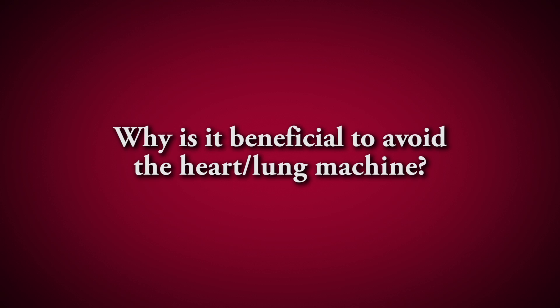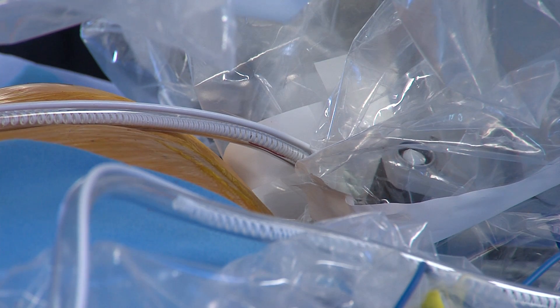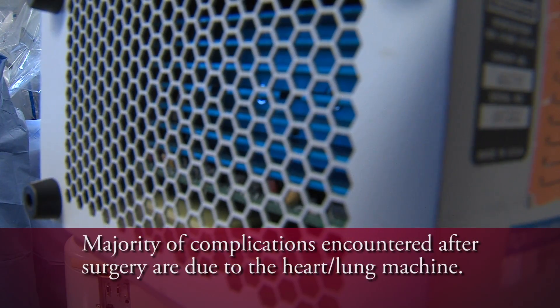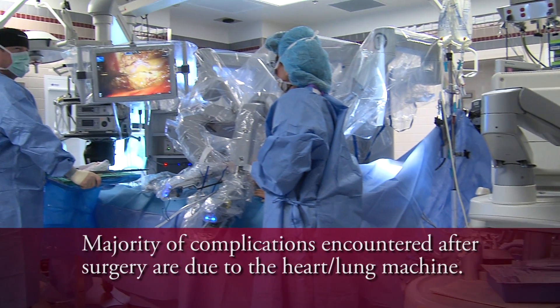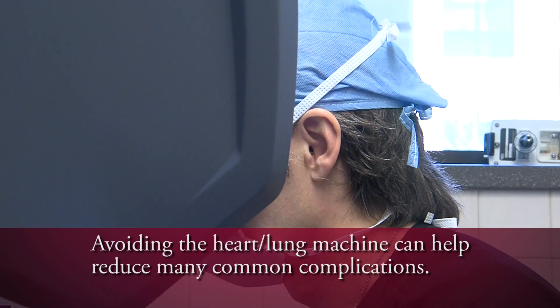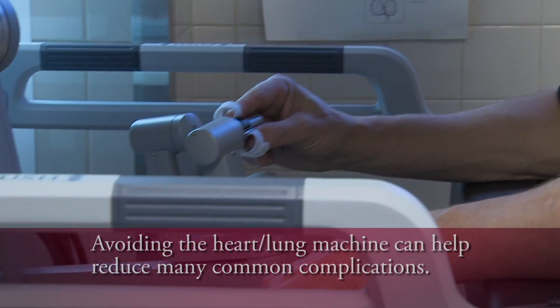The best part about that for the patient is that human blood is not exposed to a foreign body surface. We know from our experience that the great majority of complications a patient will experience after coronary bypass surgery are due to the heart-lung machine itself. So if you can avoid the heart-lung machine, it stands to reason that you can avoid a lot of the common complications.